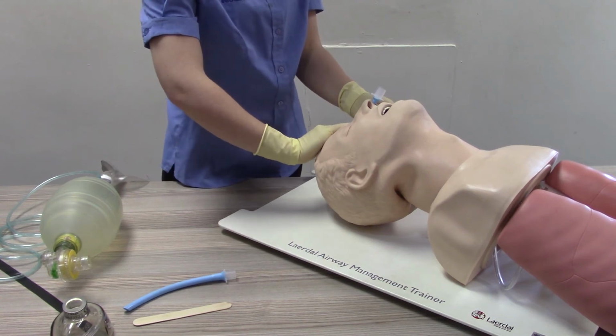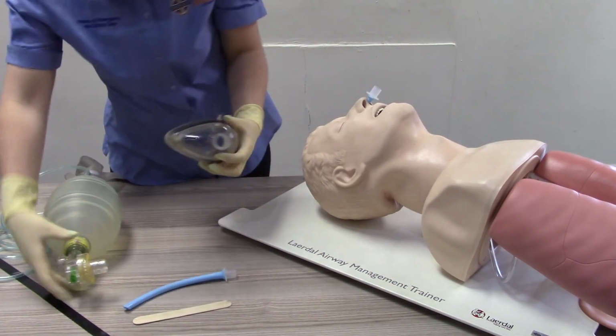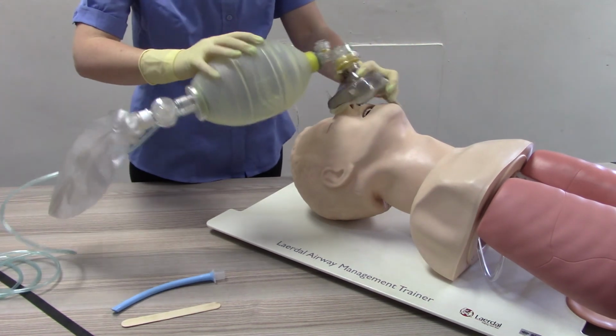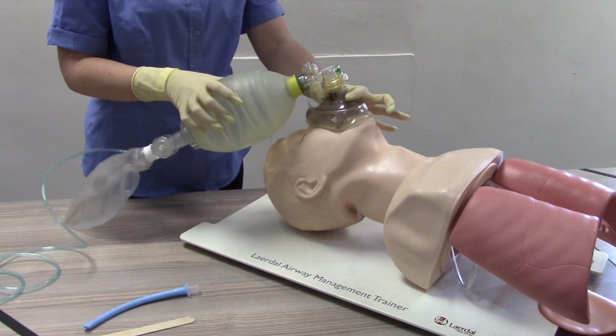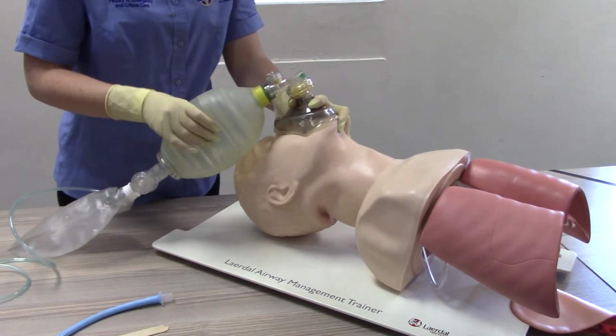Place the pointed end of your BVM mask over the bridge of the patient's nose. Clamp the mask to the patient's face by forming a tight seal. Compress the bag until chest rise is observed.